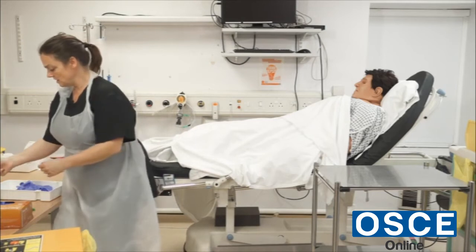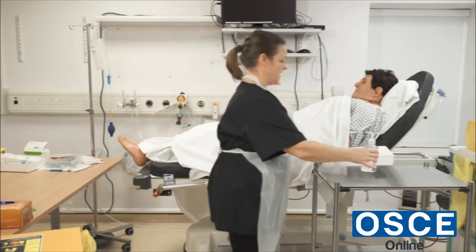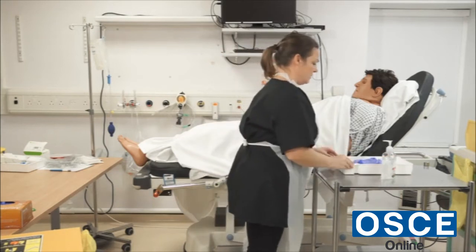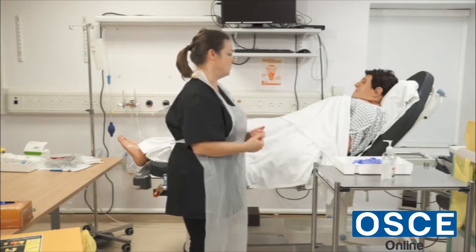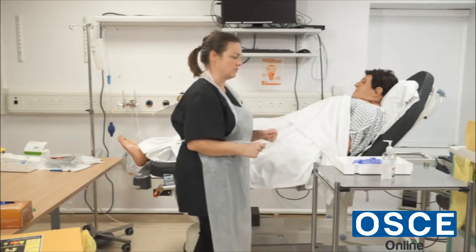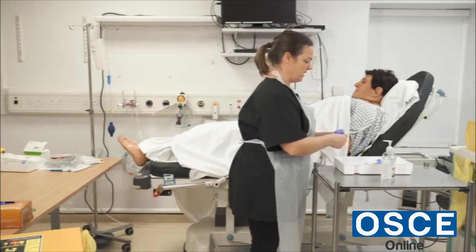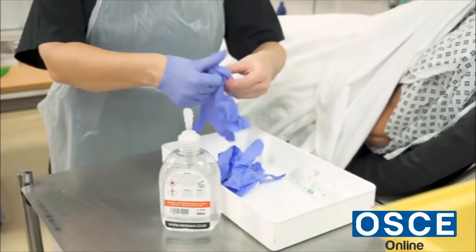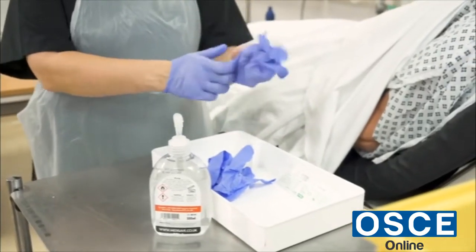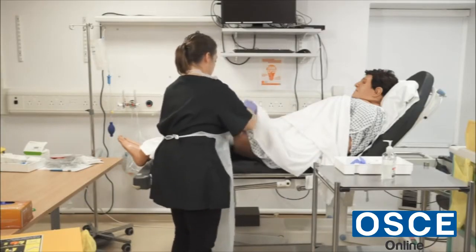I remove the gloves, gel my hands, and take the alcohol gel with me. Back with the patient now — if you're still happy to go ahead with the removal of the catheter, we'll proceed. I'll again make sure the area is screened for privacy and dignity, and I'm going to don some gloves first. I'm just going to minimally expose the patient.